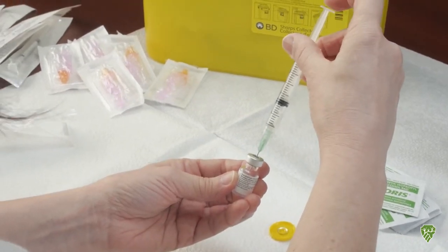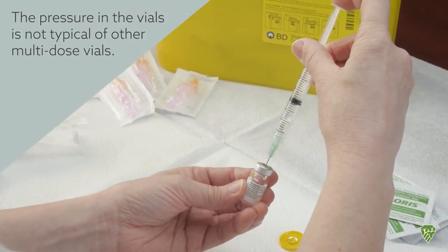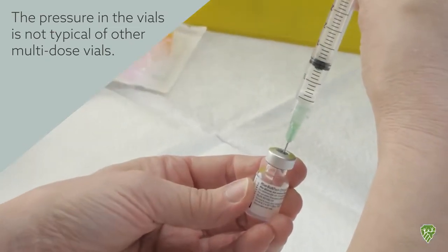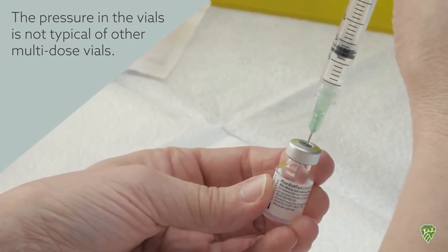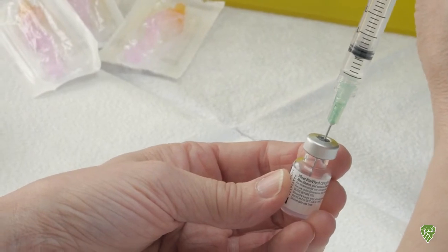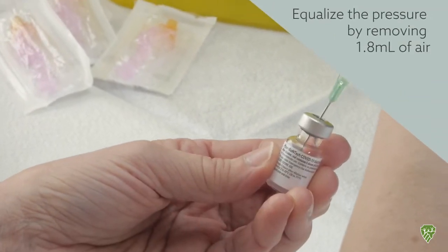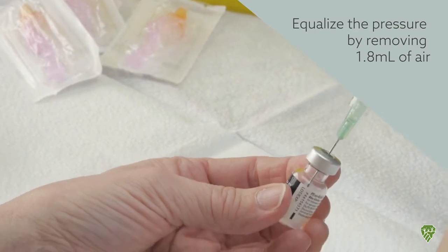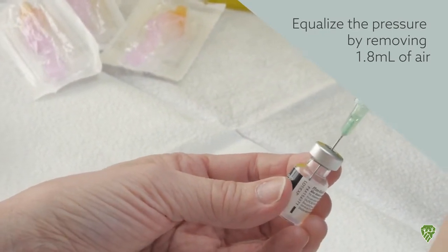And sometimes letting some of that air come back into the syringe helps to get all of the diluent in so that there's none left in the syringe at all. And then we just equalize the pressure by removing that 1.8 milliliters of air.